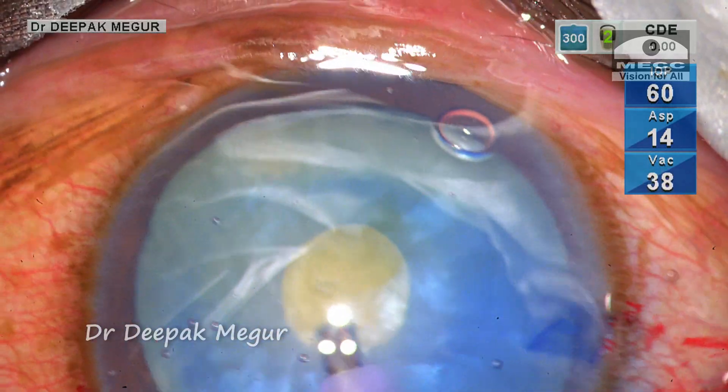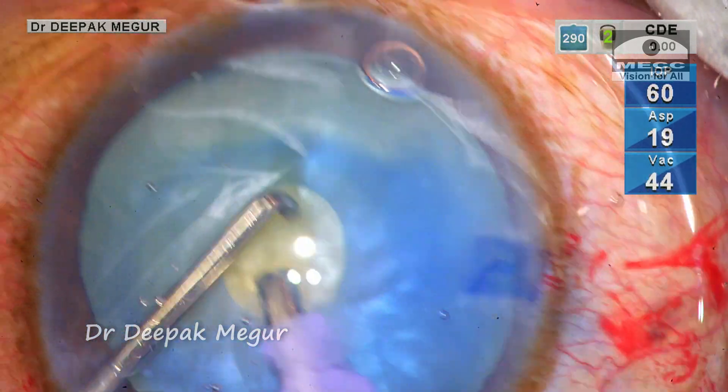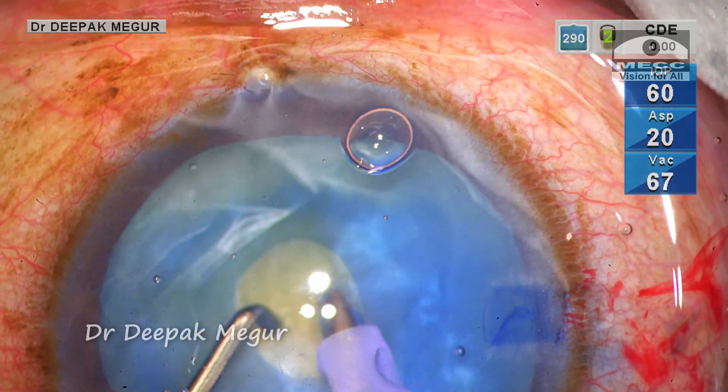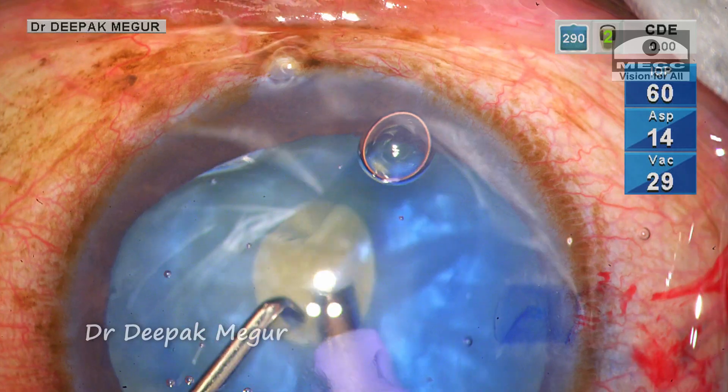I prefer the phaco tip as its wider bore allows for quicker decompression of the bag. Since the opening is very small, I need to be careful not to damage the anterior capsule. I am using the second instrument to gently nudge the nucleus around so that the swollen cortex behind and in front of it loosens up.